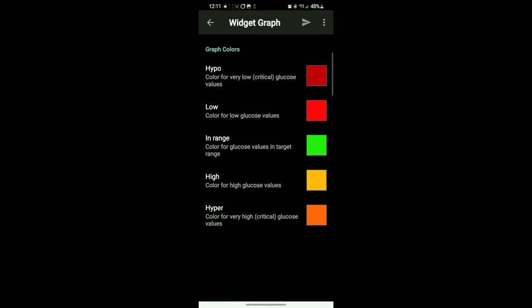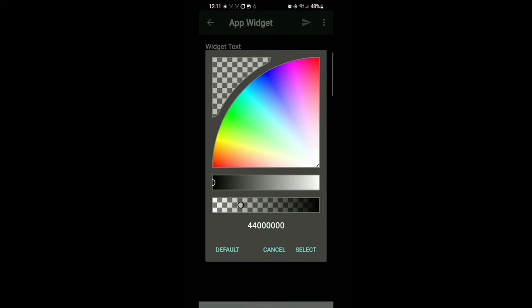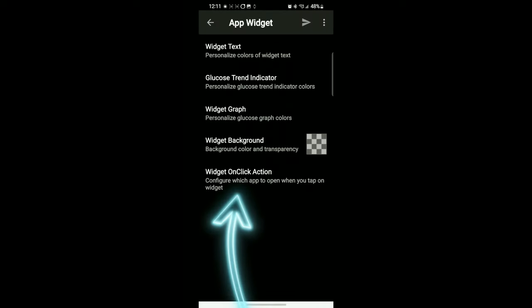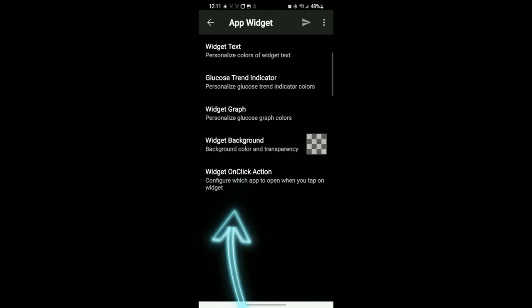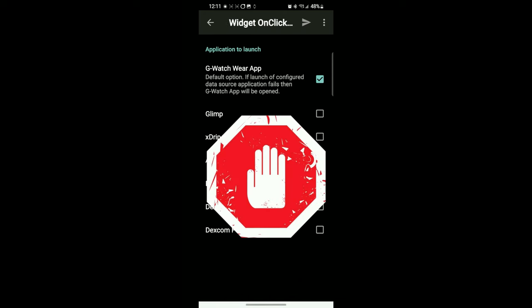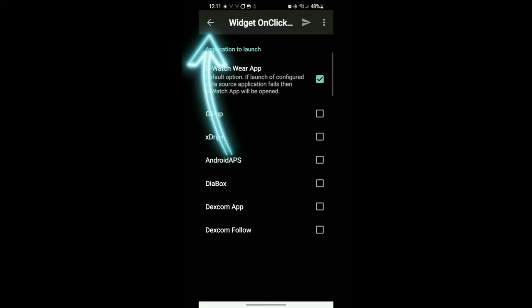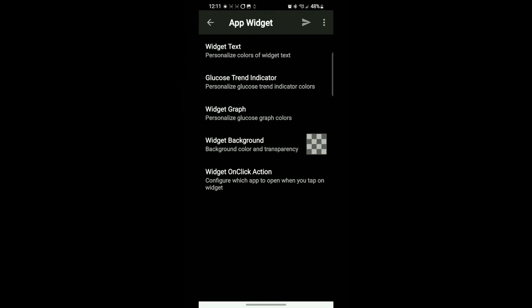Widget graph and widget background. I messed with this a little bit at first and really what it does is it puts a colored square behind the app and it looks not cool, so I just left it black. Widget on click action, don't do anything, just leave it G Watch Wear app and we'll go forward.